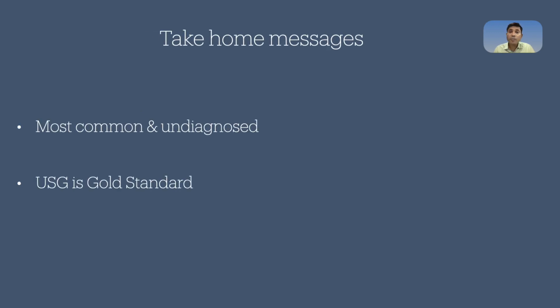So our take home message will be, it is the most common and undiagnosed problem of the ICU, which can lead to spontaneous breathing trial failure or weaning failure. And of course, ultrasound is the gold standard to diagnose it.